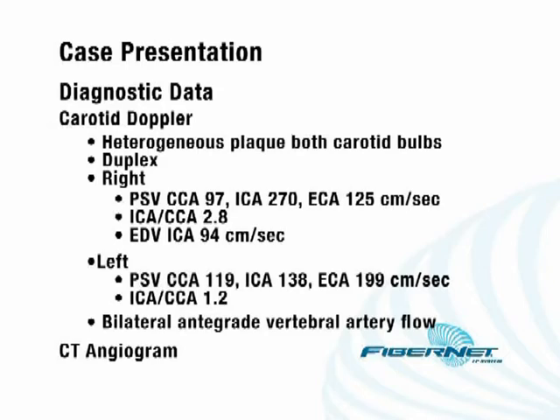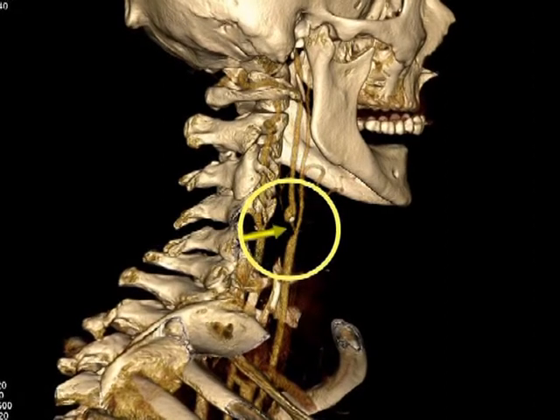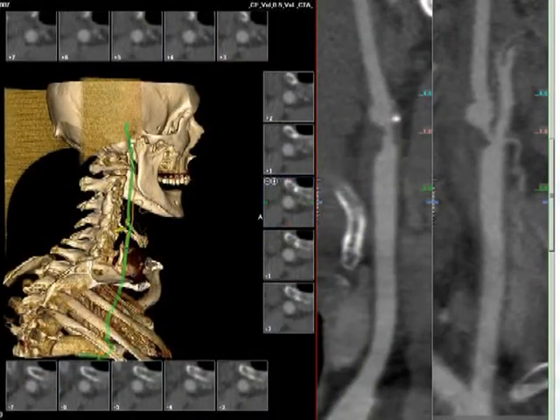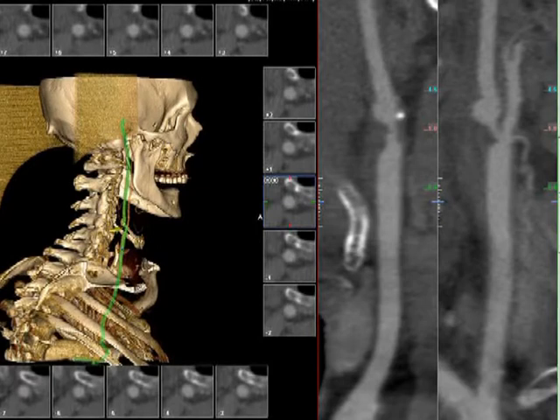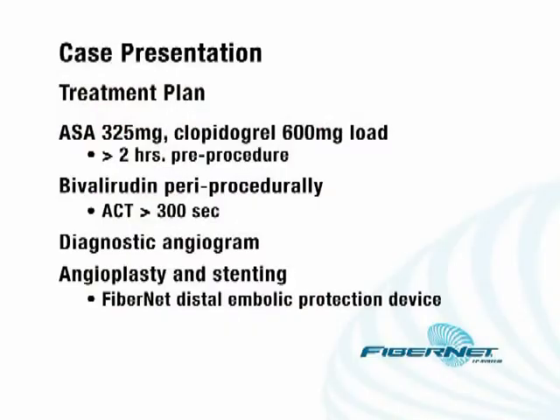A CT angiogram was performed demonstrating a relatively high-grade narrowing in the proximal right internal carotid artery with some post-stenotic dilatation. The origin of the aorta shows this is a type 1 aortic arch. The proximal great vessels are relatively straight. Distal to the stenosis, there's a relatively long straight landing zone, which makes this favorable for a percutaneous revascularization. The internal carotid measures approximately 4.5 millimeters, the common carotid measures approximately 6 millimeters, and the lesion itself measures approximately 1 millimeter.